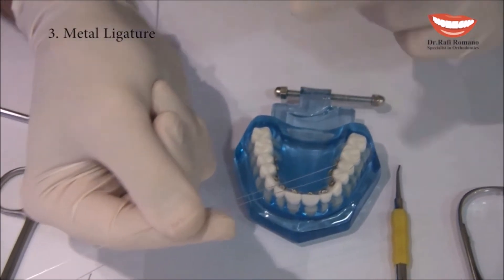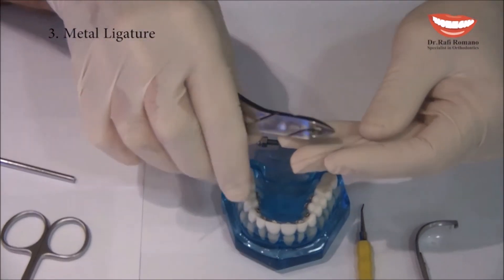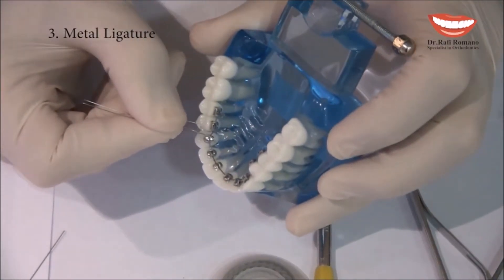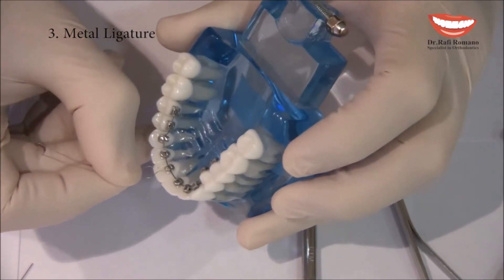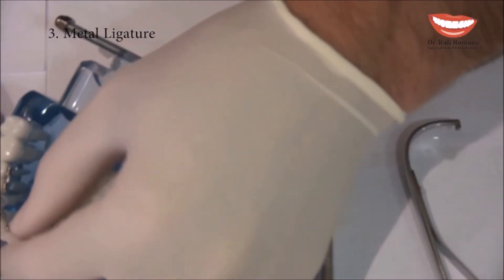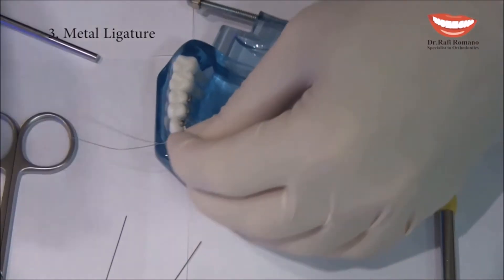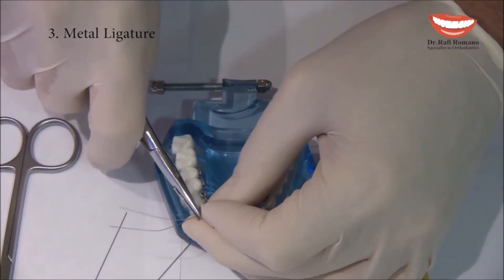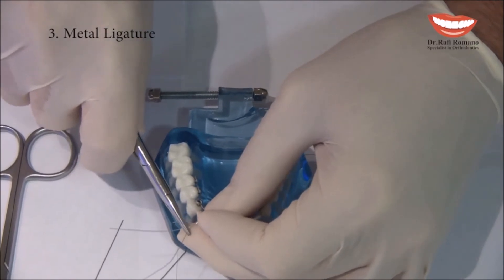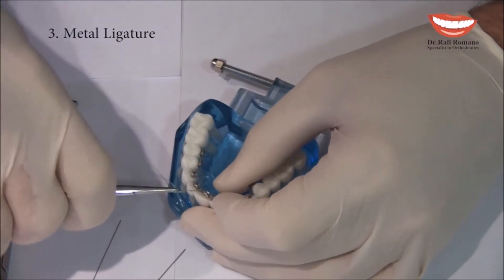Metaligatures usually come very long, so first I cut to make it shorter — it's much easier to work with when it is short. I place it around the central incisor, just like we do with an elastic module, going around the two wings. Then I take the mosquito, hold it close, and start wrapping the metaligature.